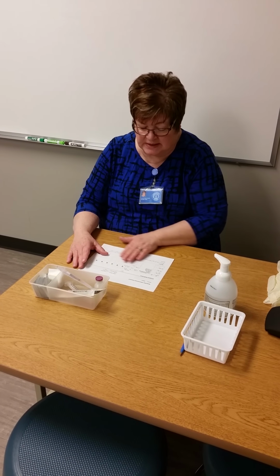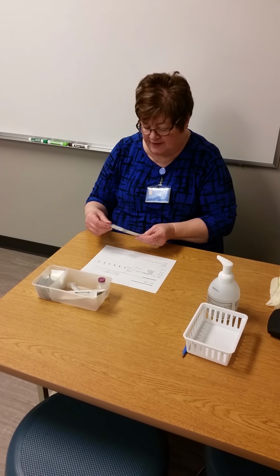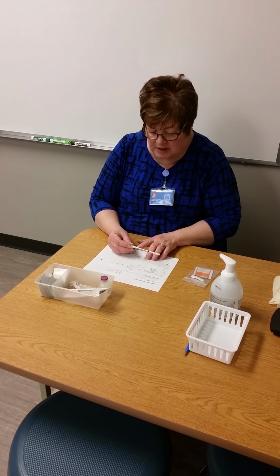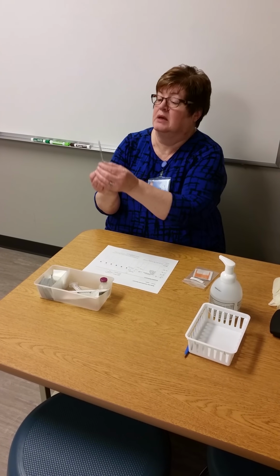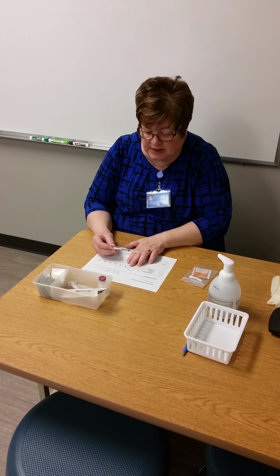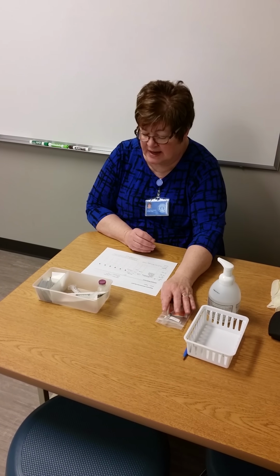Casey Banks 10-2-1965, I need Tubersol. I go into my med cart, and I find Tubersol, which has been pre-drawn by pharmacy. Tubersol, intradermal injection, today only, 0.1 ml of fluid. Due at 0900, and it has not been given on today's date. I'm going to set that aside.